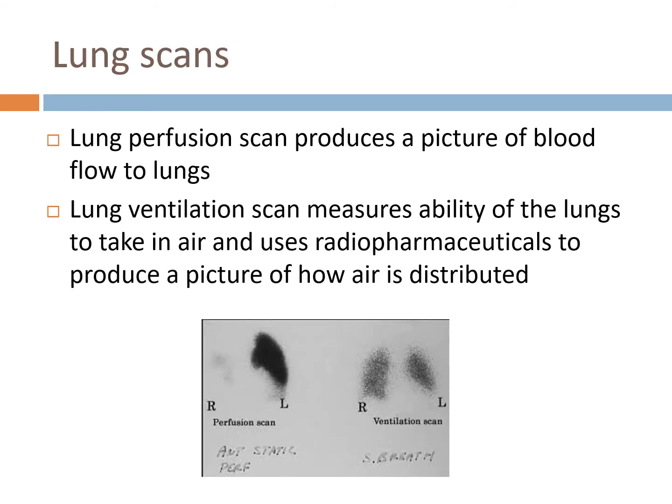All right, this is something that they really don't do anymore. They used to. The lung scans, the ventilation perfusion scans, provide a picture of the blood flow to the lungs. They inject a dye, and they also inhale something. Radiopharmaceuticals, so the radioactive agents are either injected into the bloodstream or inhaled into the lungs. Again, these are hardly used at all anymore to see whether or not they have a pulmonary embolism.